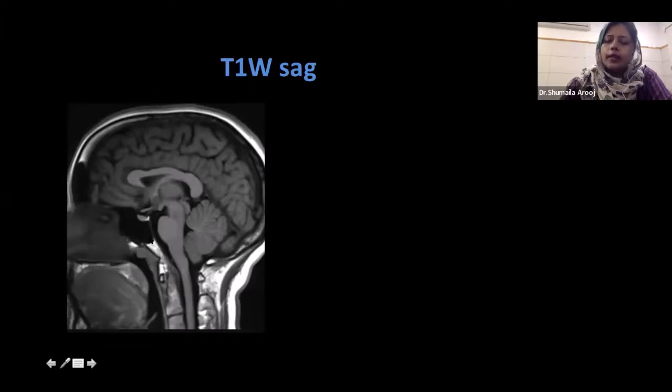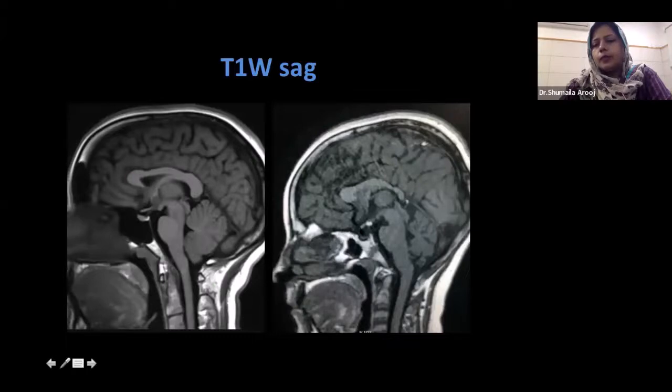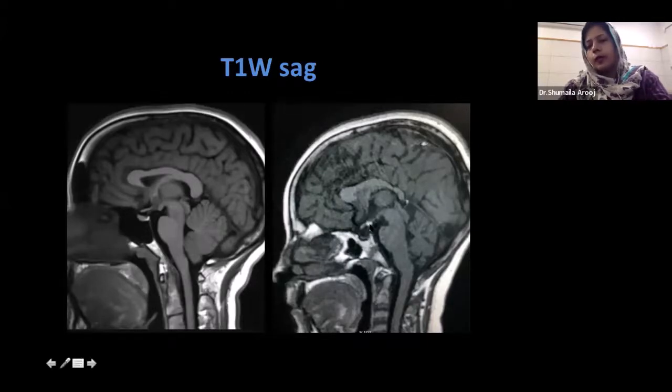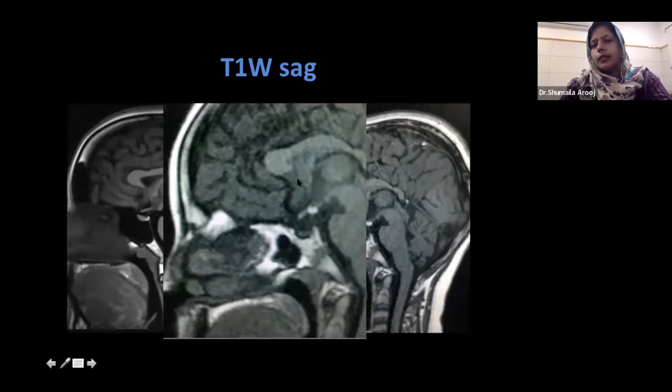We also perform T1-weighted sagittal images for the midline structures — for example, the brain stem and infratentorial structures are seen very well on sagittal images. Specifically, we do this for the pituitary, because on plain T1 you can appreciate the difference between the anterior and posterior pituitary. The posterior pituitary has a bright focus lying at its position. This was a 15-year-old girl who had all the symptoms of hypopituitarism. When we imaged her, we could see that the bright spot of the posterior pituitary was ectopic in location — there was a pituitary transection. The posterior pituitary was lying at an ectopic position in this patient who had all the symptoms of pan-hypopituitarism.